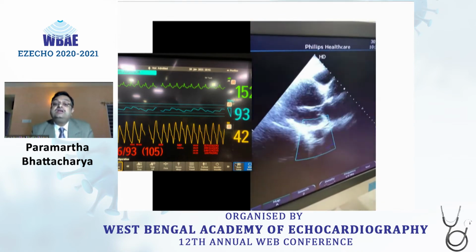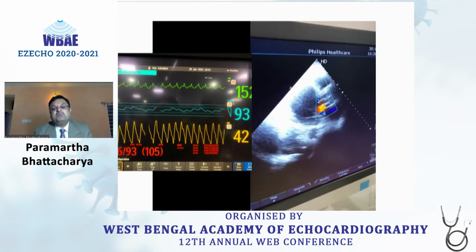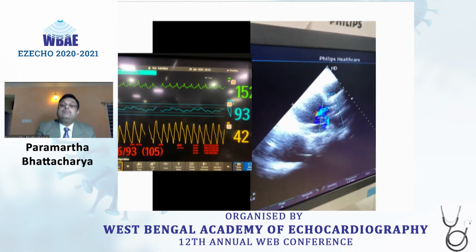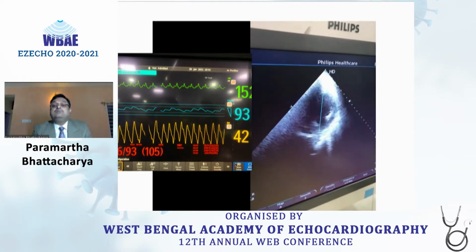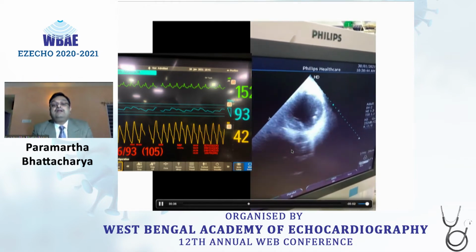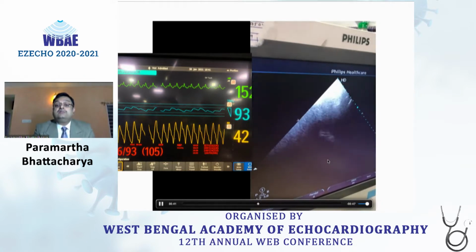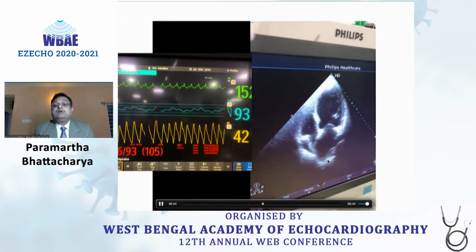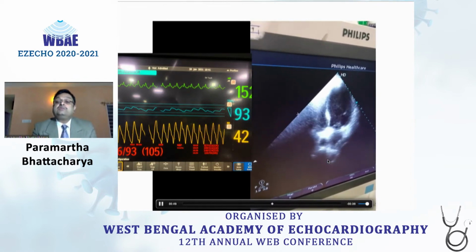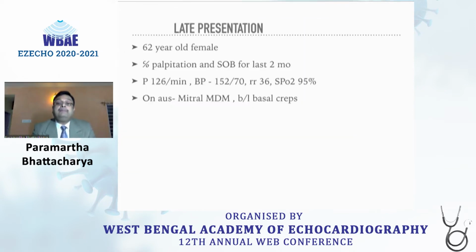The patient was initially treated with decongestion and nitroglycerin. When the pressure started falling, we had to put the patient back on inotropes. Within 2 hours or so the patient quietened down, but became really bad and had to be put on the ventilator. The patient is still fighting on the ventilator. We don't think we'll be able to salvage this patient. And this was the echo. You can see how poor the ventricular function was. We wanted to see whether this patient has instent thrombosis or not, but the patient is not well enough to be wheeled down to the cath lab.